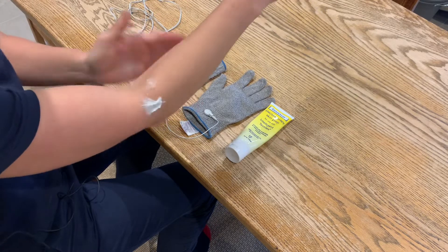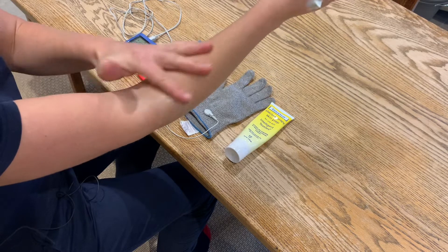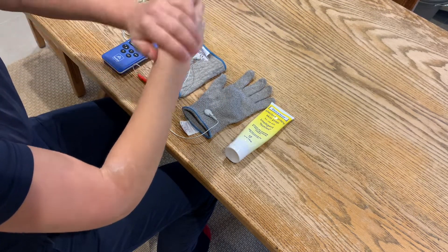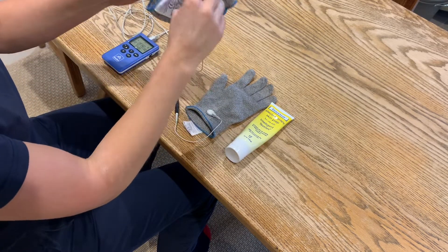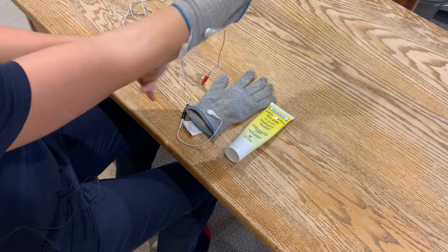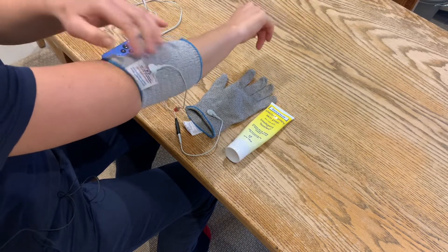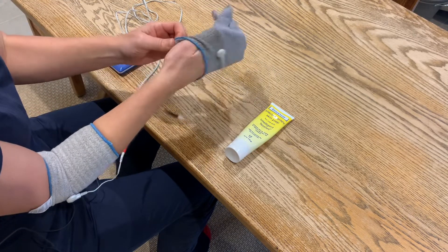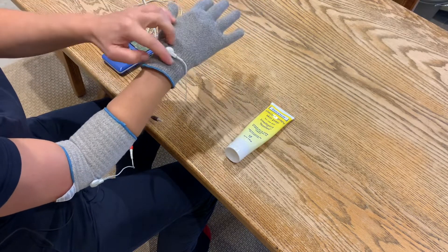Go right around. You don't want to rub it in so much that it disappears — it wants to be quite tacky. Cover both sides of the hand. Then put your sleeve on first, right up around the elbow with the connector visible. Then put your glove on, pushing your hand right in so it's a good fit, with the connector on the top.